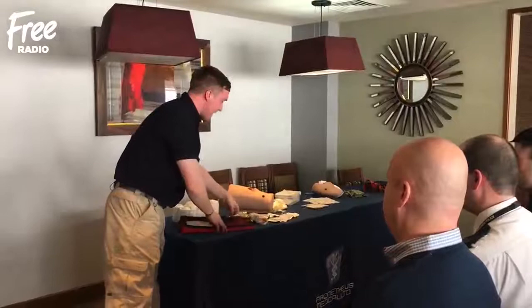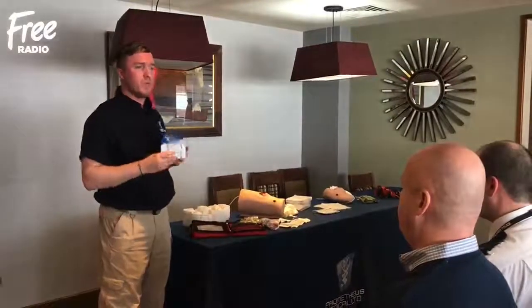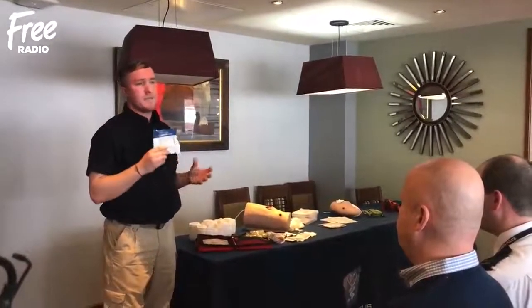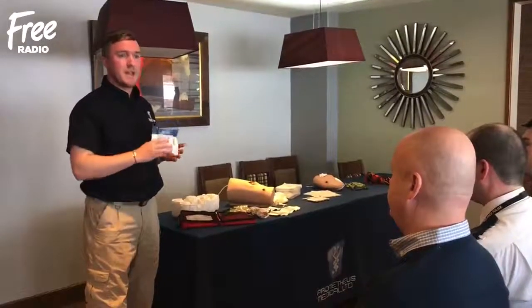Now, we've got a haemostatic gauze, which is called Chito Gauze XR Pro. This is for packing into wounds, and when we have things like knife wounds, they can sometimes really present that they need this. It has a haemostatic agent on the actual gauze, which is going to form a clot within about three minutes and then prevent any further bleeding.